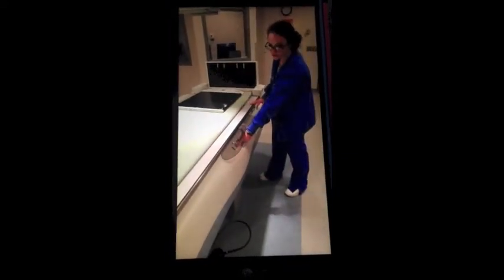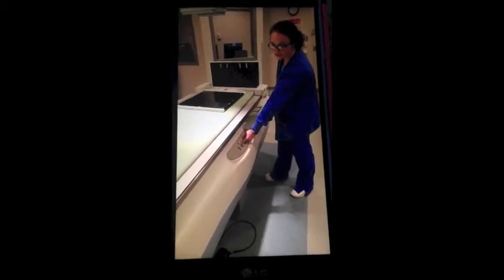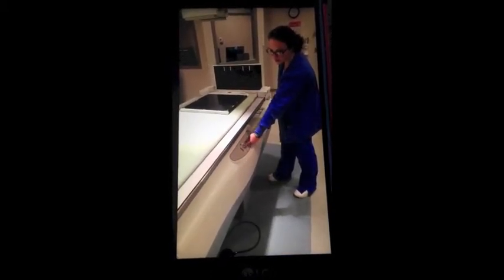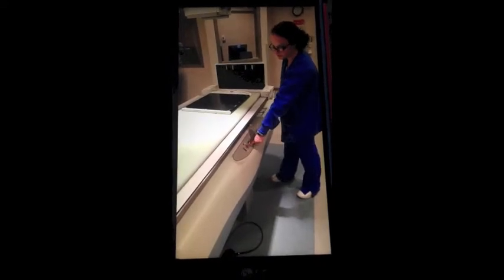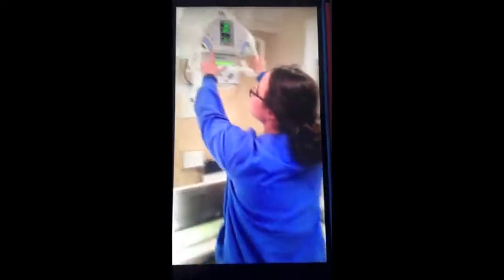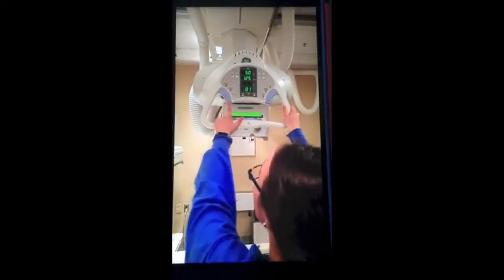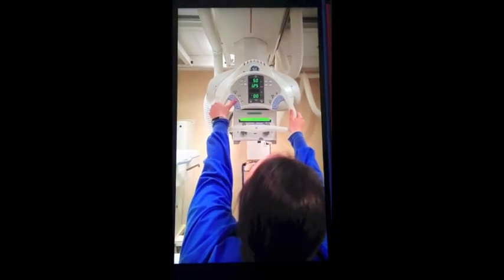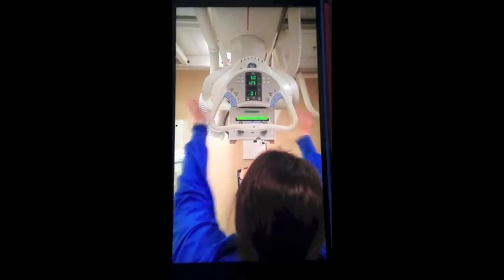And how Mieke showed you how to use the buttons, you have your side button that goes this way. One that goes this way. Up. Down. And then this is your tube. You're going to have to make sure you have your detent button on. What you're going to do is take this one, and you'll just feel a little knock whenever you hit the detent, and it'll be stuck in there.